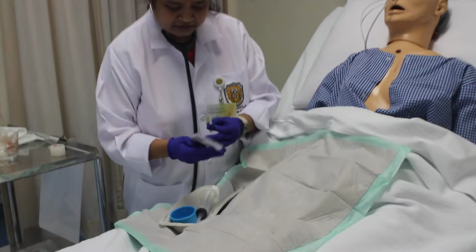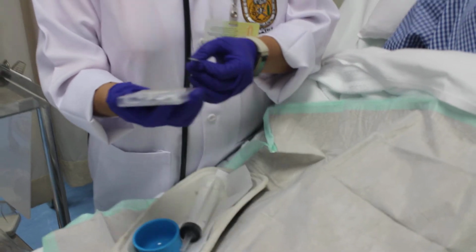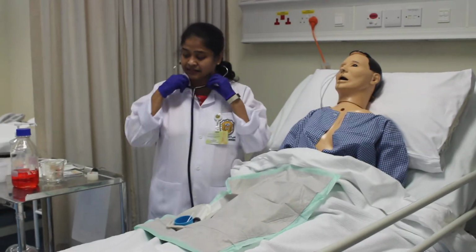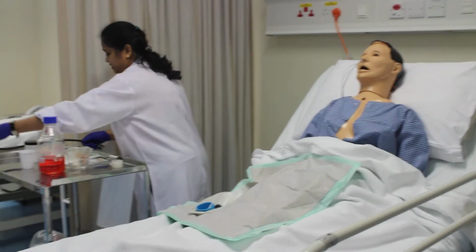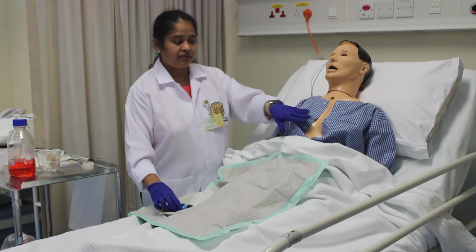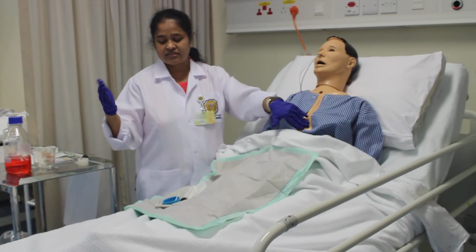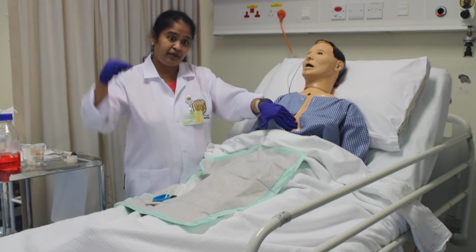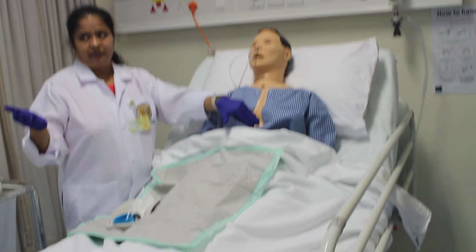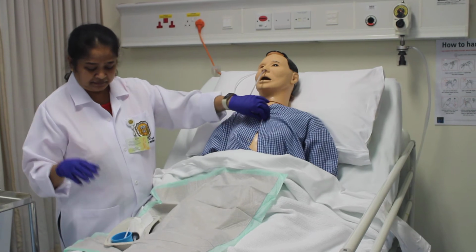The change in the color of the strip says that the pH is 3. We know that the gastric contents are acidic, usually 2 to 6. Because it is 3, I know it is there in the stomach. If it is 6 and above, mostly it will be duodenal juice, so maybe you have gone more into the duodenum. At 7 and above, you should be doubtful whether it is in the lungs. So we have to be careful.